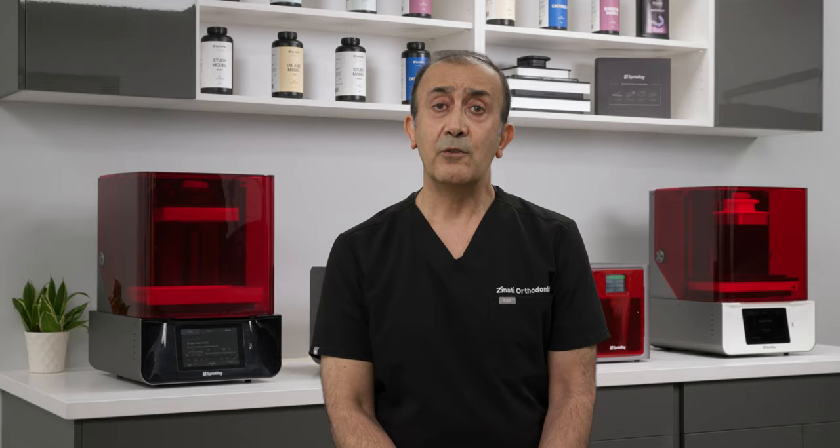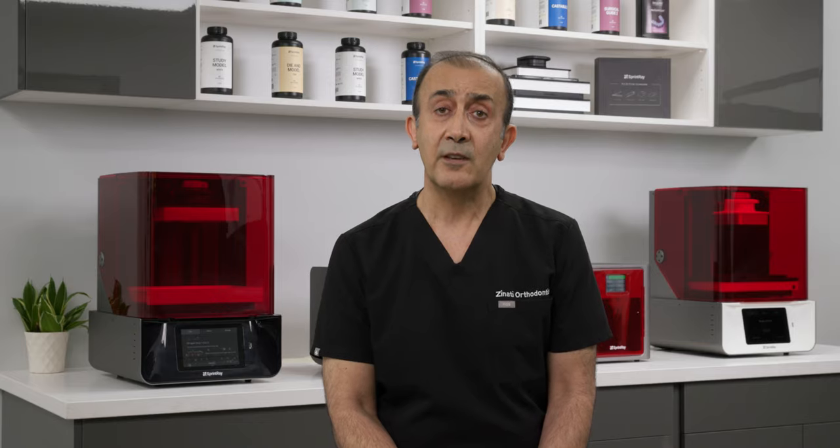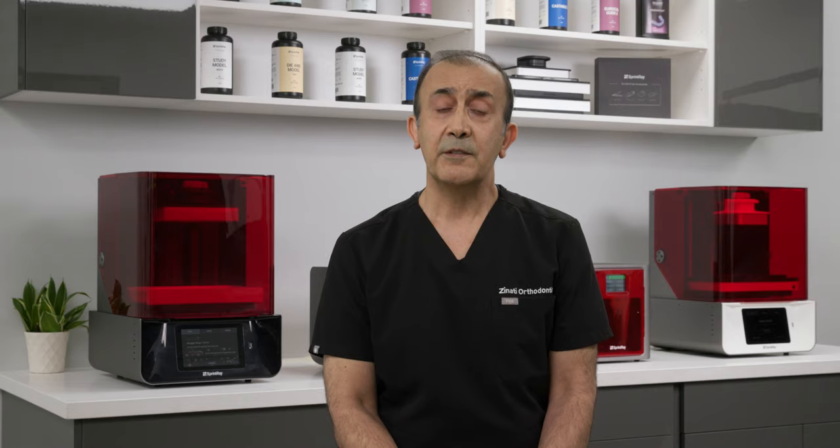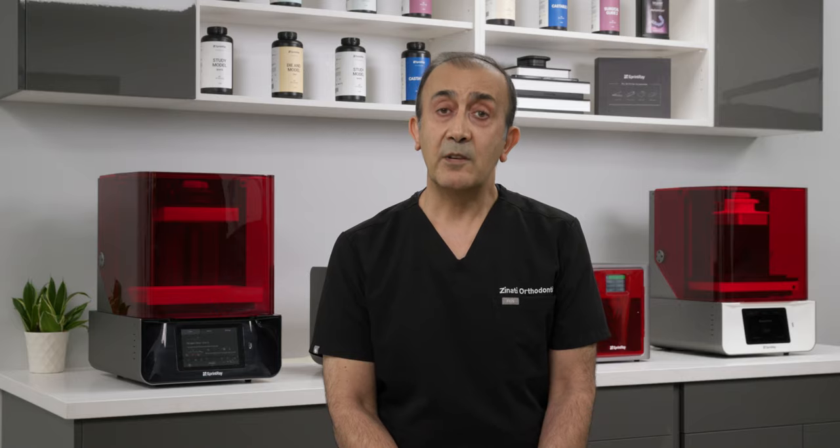Currently we're using two iTero scanners at the office including the latest Element 5 and a CareStream CS3600. At any time I usually have about 200 clear aligner cases. As a member of the Sprint Ray community I've noticed some doctors sometimes have problems printing models and also having fit issues with clear aligners or retainers.